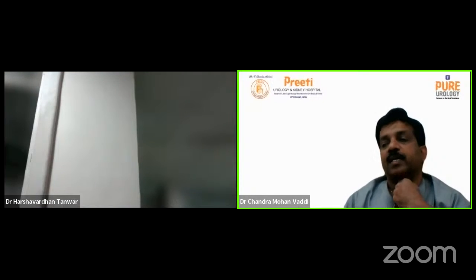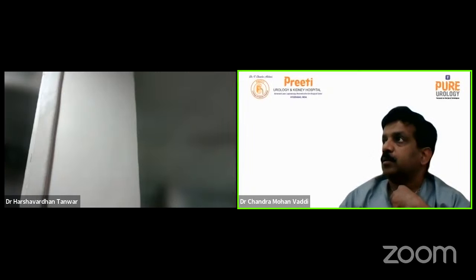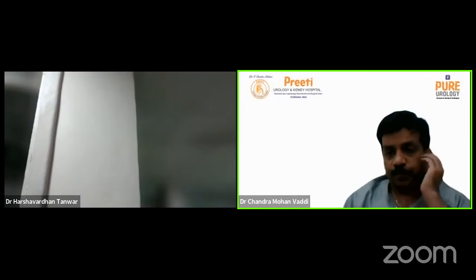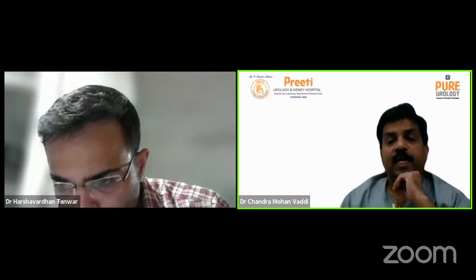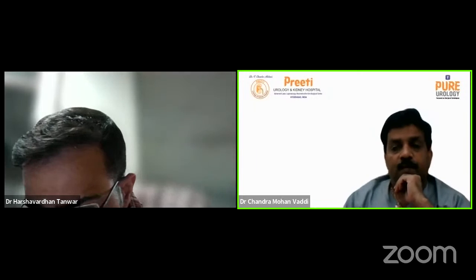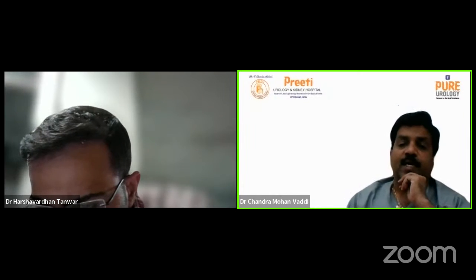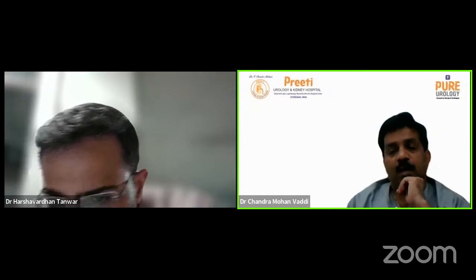For the audience who are seeing, see what he is telling the technique is. What he is telling the technique is monoplanar. Whether it can be done in all cases monoplanar or not, whether we have to believe in that, what is the advantage in monoplanar? Why can't you see another angle with limited C-arm, or the controversy?